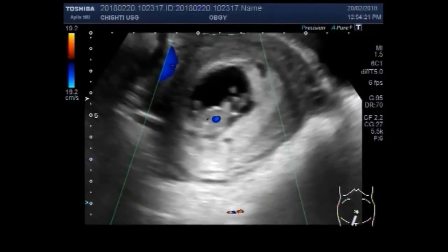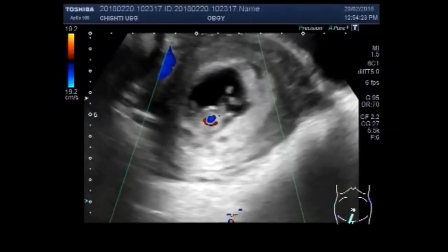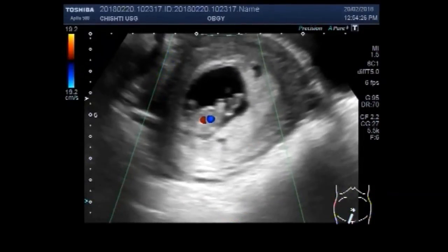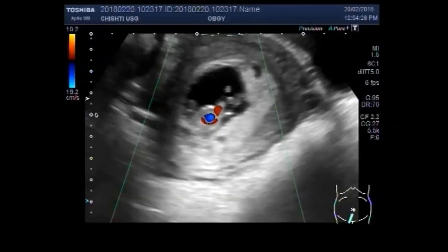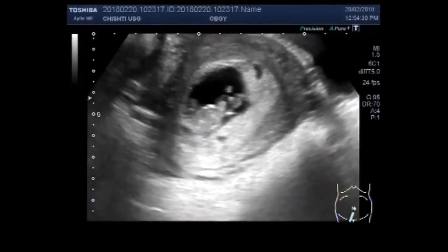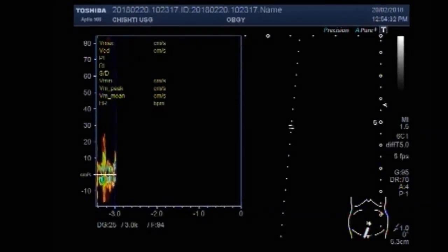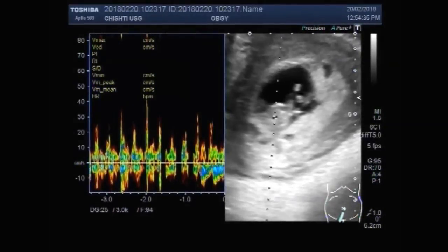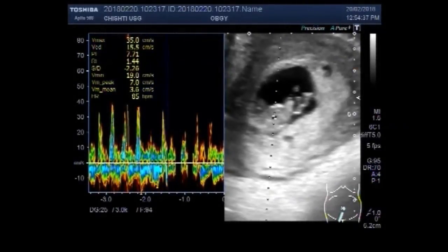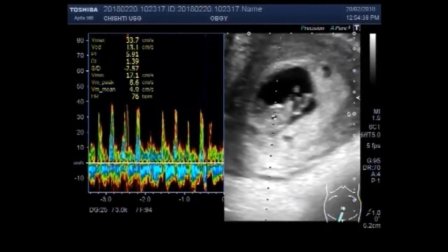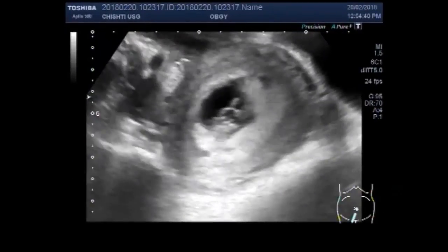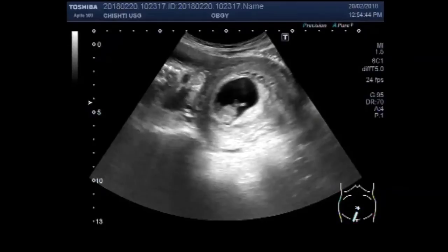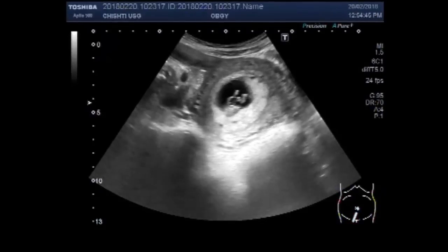Now blood flow is also seen in the fetal heart. Again the cardiac activity is seen. Now you will see a huge left ovarian cyst.